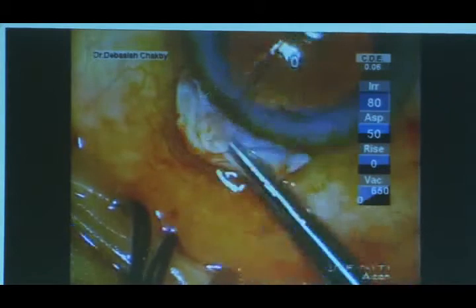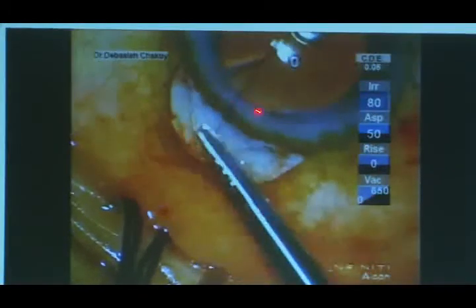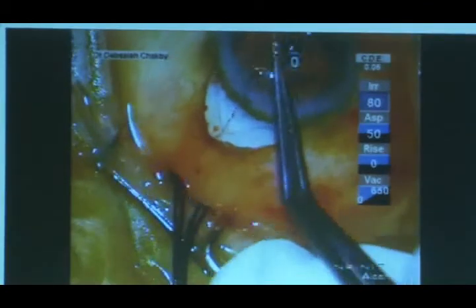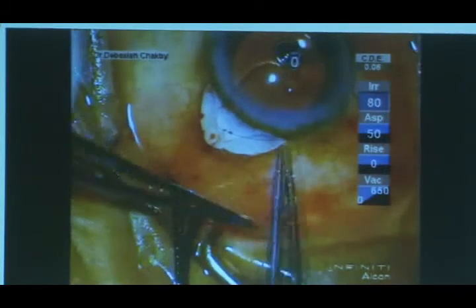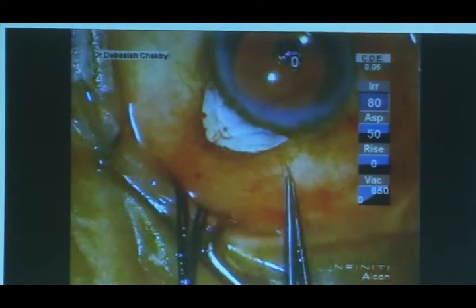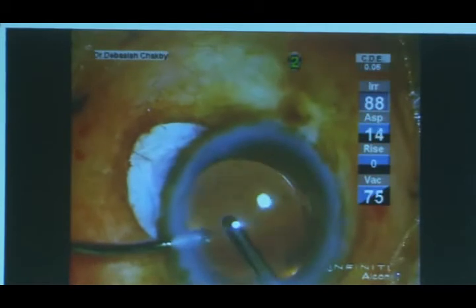And then I gently tap the superficial scleral flap to ensure that I can see this red glow through this part. So here it comes. The iridectomy is complete now. And then I close this apex with a single 10-0 nylon suture, 3:1:1, and bury this knot beneath the scleral flap so that it does not poke out through the conjunctiva.